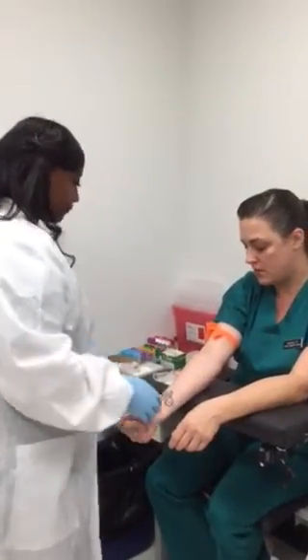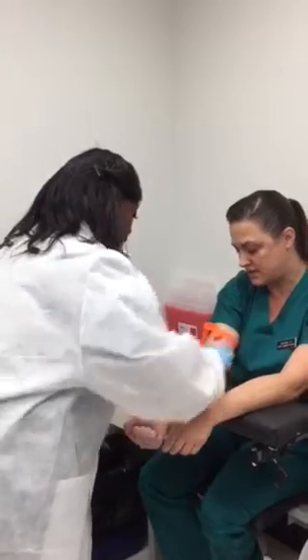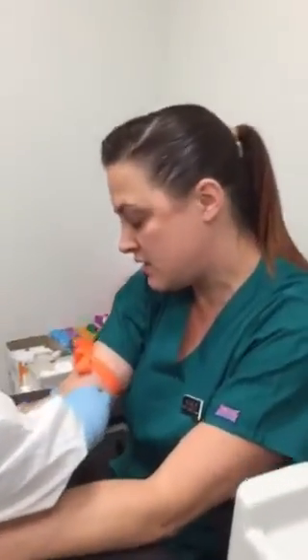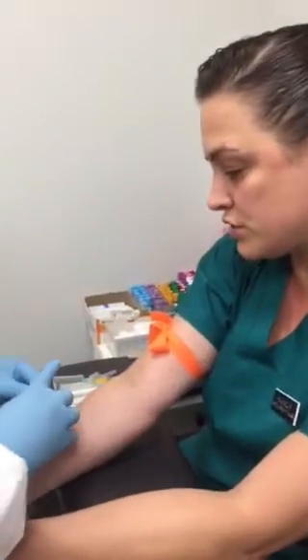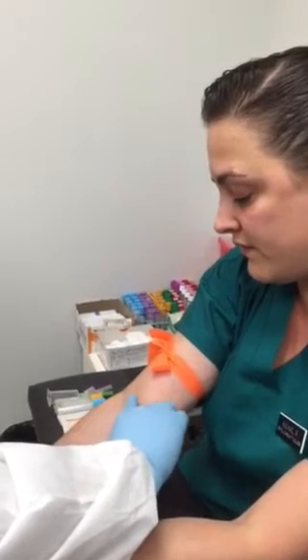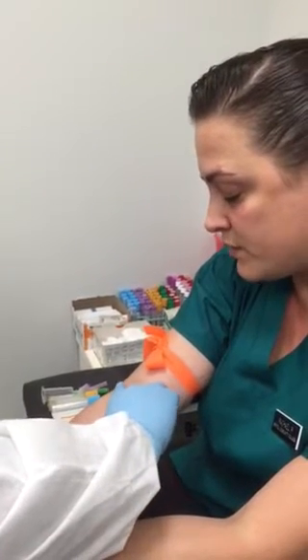Can you make a fist, please? She's going to take her index finger and palpate the vein. Make sure to not use your thumb because your thumb does have a pulse in it. You can use any of the first three fingers, whichever one you feel more comfortable with.